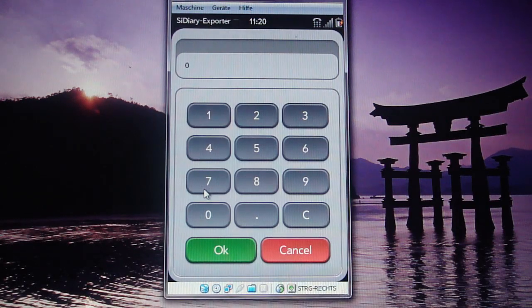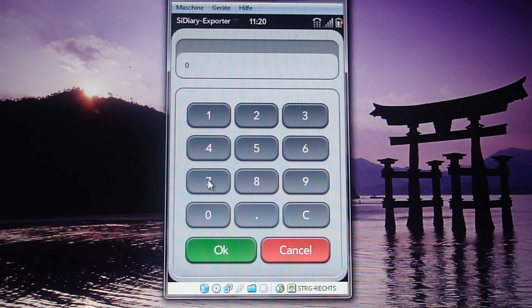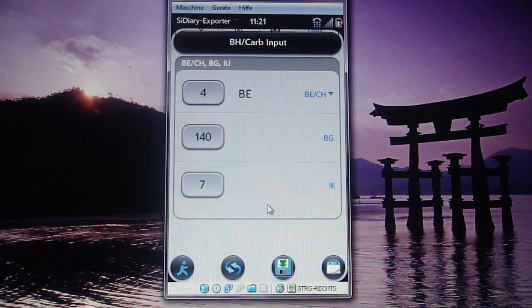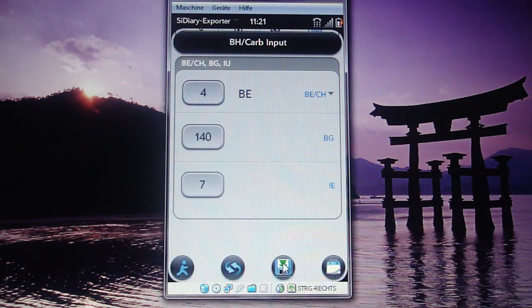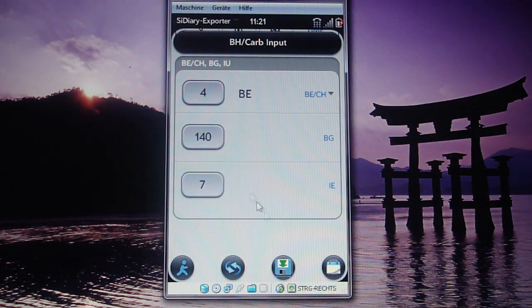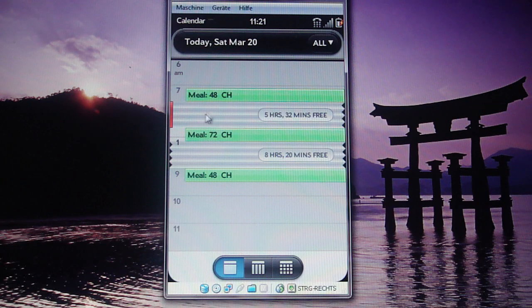You can also adjust the insulin value here — for instance if your pump can't use units below 0.5. You can enter a different value, say 7 units, and hit OK. Then you hit the save button and this information is saved into your calendar. If you want to review it later, just hit the calendar button or open the calendar from the tool, and you see what you have eaten through the day.